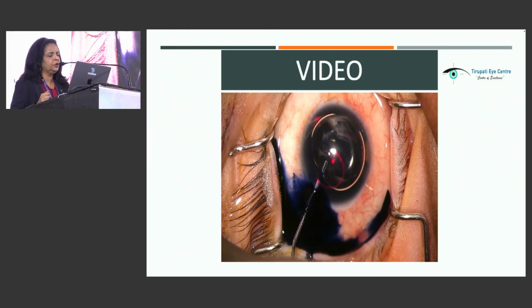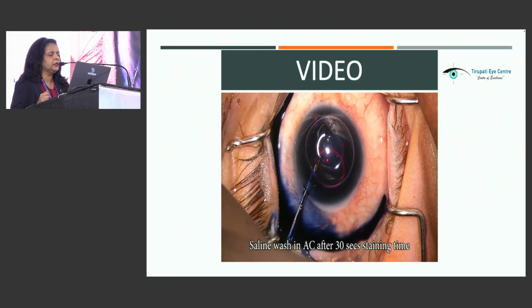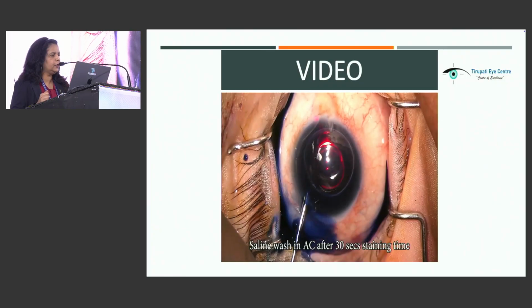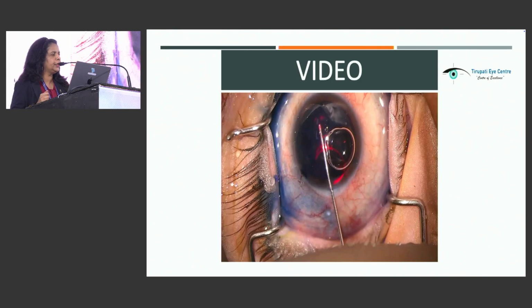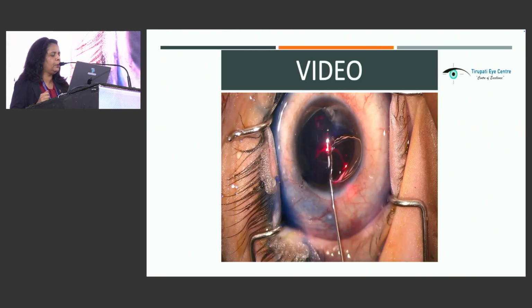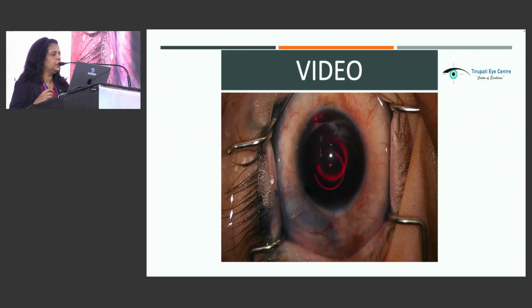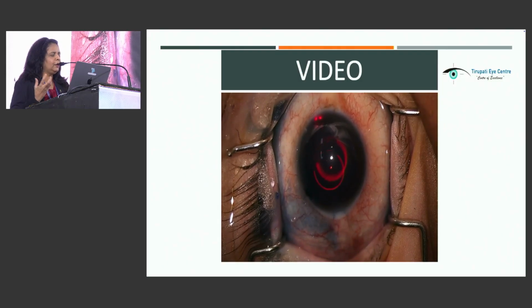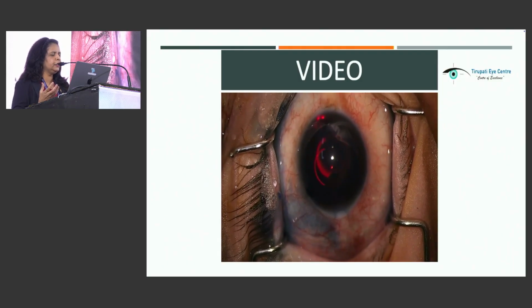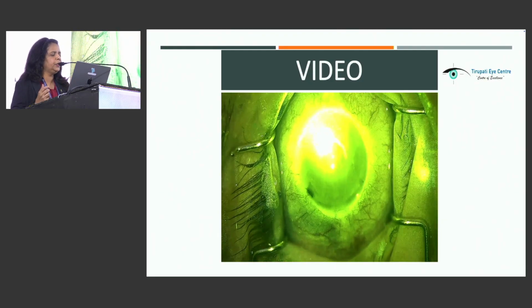The two different things that we do compared to any regular cataract surgery is, one is the stain that is used is of higher concentration, and secondly, the viscoelastic is also of a much higher concentration, because these have been optimized by trying various permutations and combinations to find out which is the medium through which laser will travel the best, and which is the concentration of the stain where the laser uptake will be optimal.